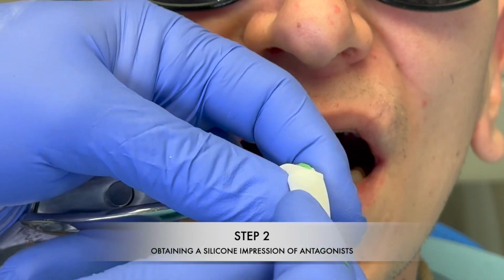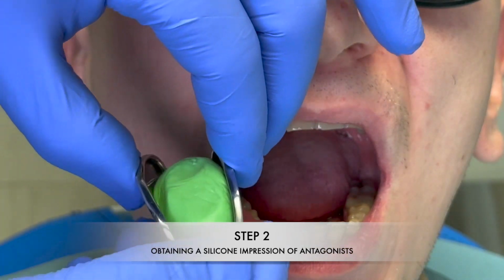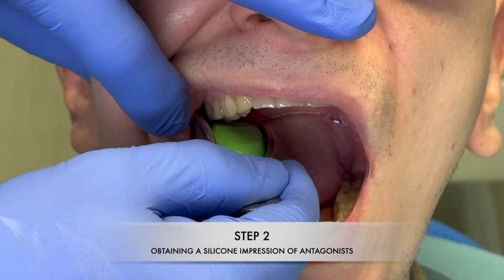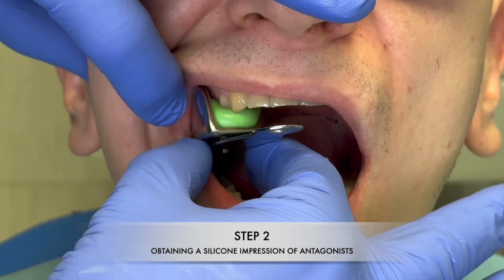Step 2. Obtaining a silicone impression of the antagonist teeth. For this purpose, I use a short impression tray, as the walls of the tray create compression of the silicone, and the impression is accurate.